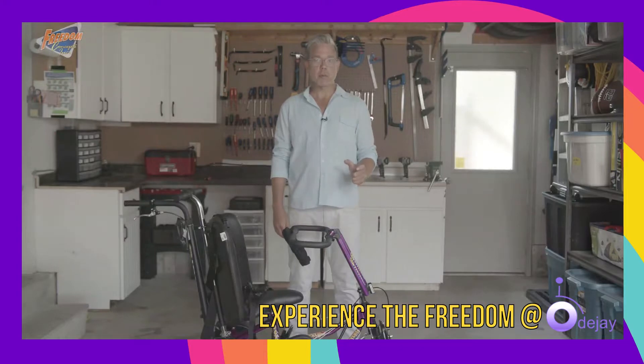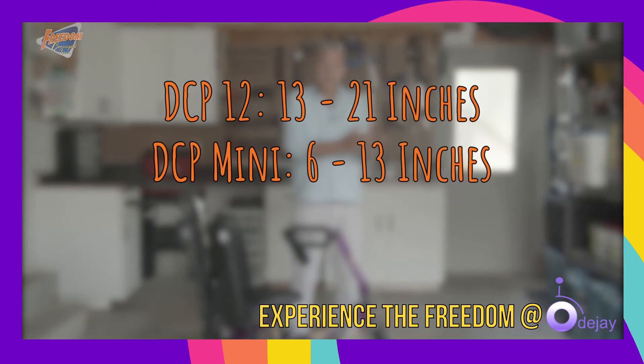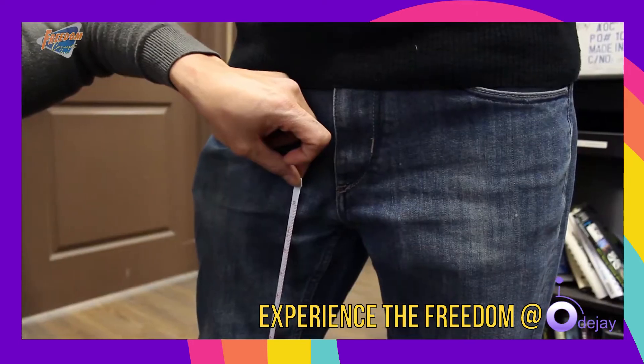The inseam measurement of the rider will determine the appropriate size needed. In this video, I will be showing you the DCP-12. The inseam range for this cycle is between 13 and 21 inches. The smaller cycle called the Mini can accommodate an inseam range from 6 to 13 inches. The larger cycle, DCP-16, is 19 to 26 inches. You can determine your inseam by measuring the distance from the bottom of your heel to the top of your inner thigh.